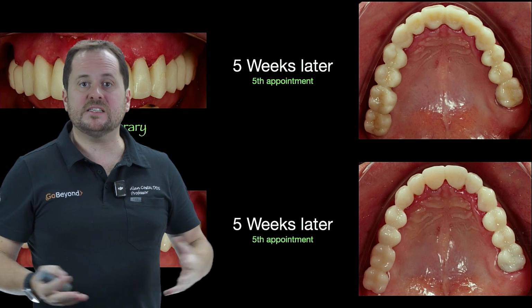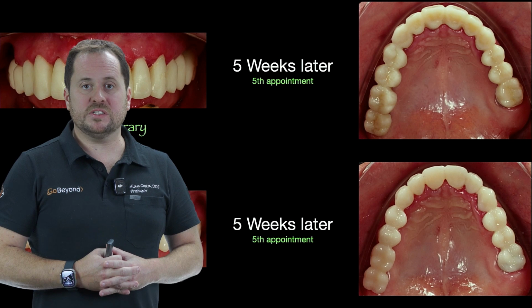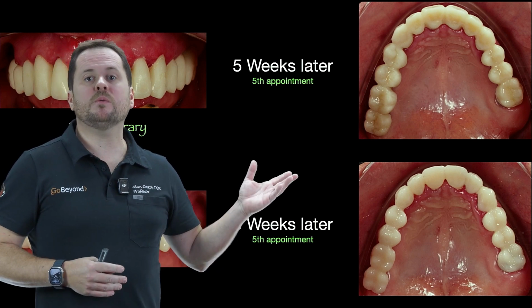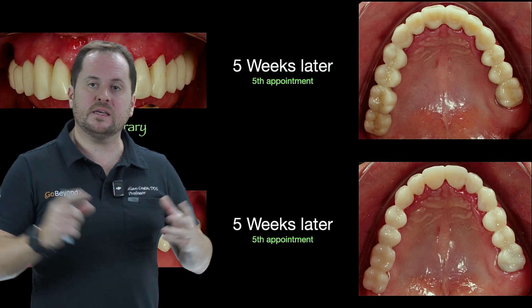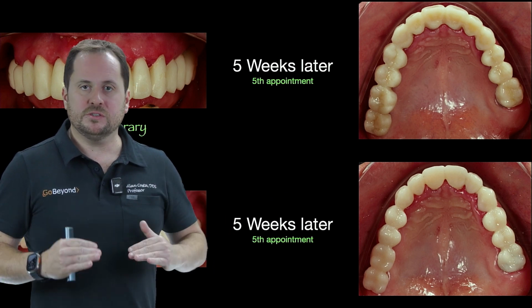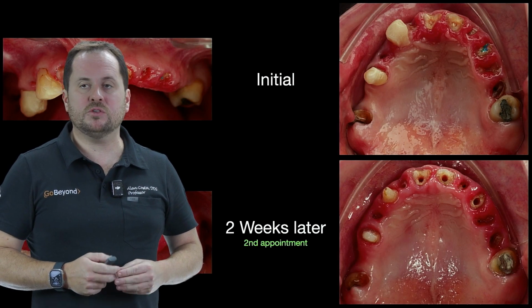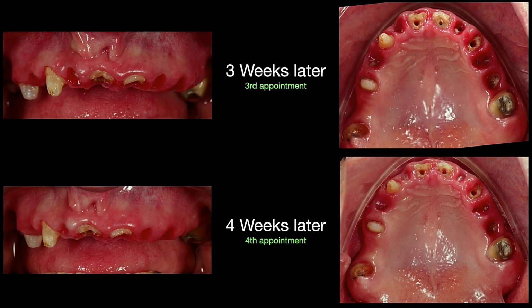Unlike the old prosthetic devices, the way we used to work, which many people still do, where you have to do tooth assembly, waxing, and all those procedures to get it done, and this process is more expensive, here we feel very comfortable because with these improvements we are making, we have a digital file of the patient, and we implement these improvements for the patient, having the confidence of a lower cost. We can definitely print as many sets as needed, having confidence in the aesthetic aspect and the durability of this provisional. So here, these images show the entire progression of the case for you.